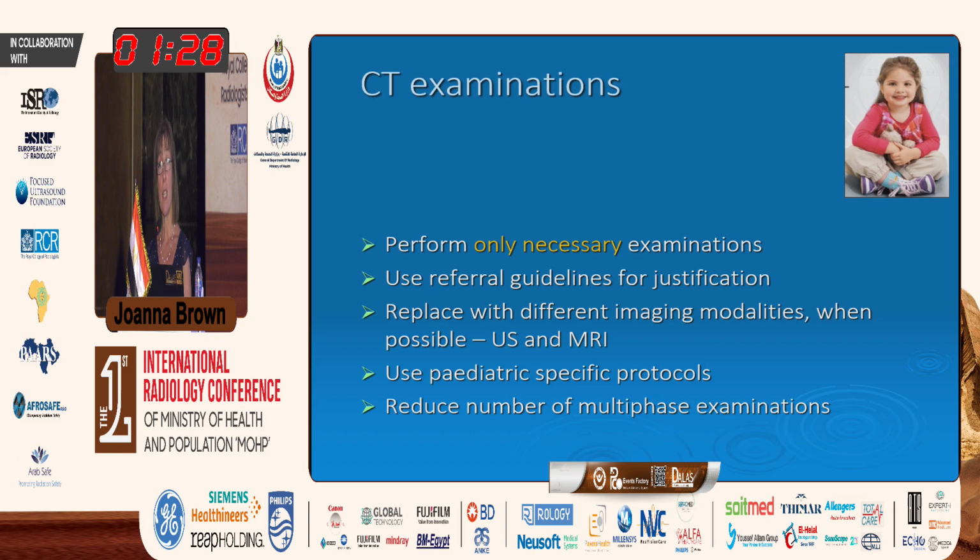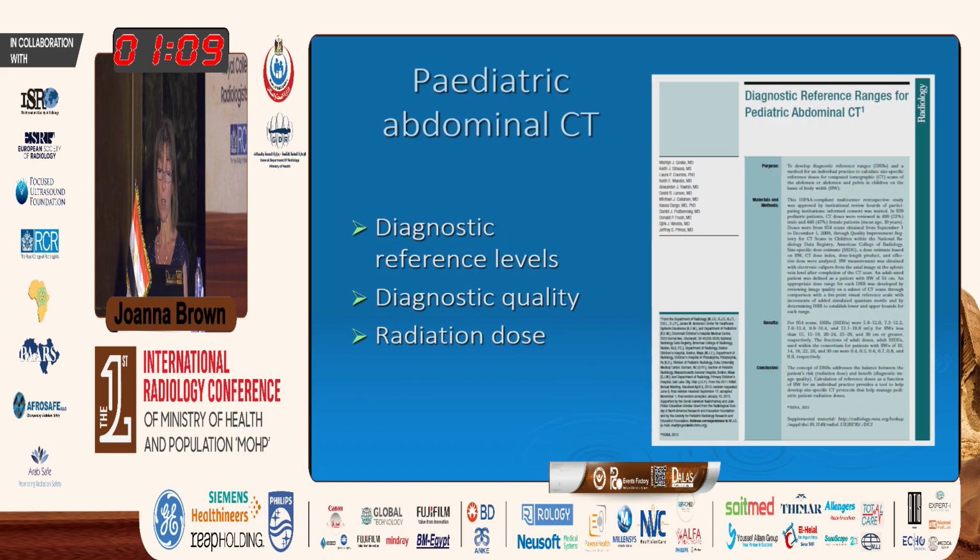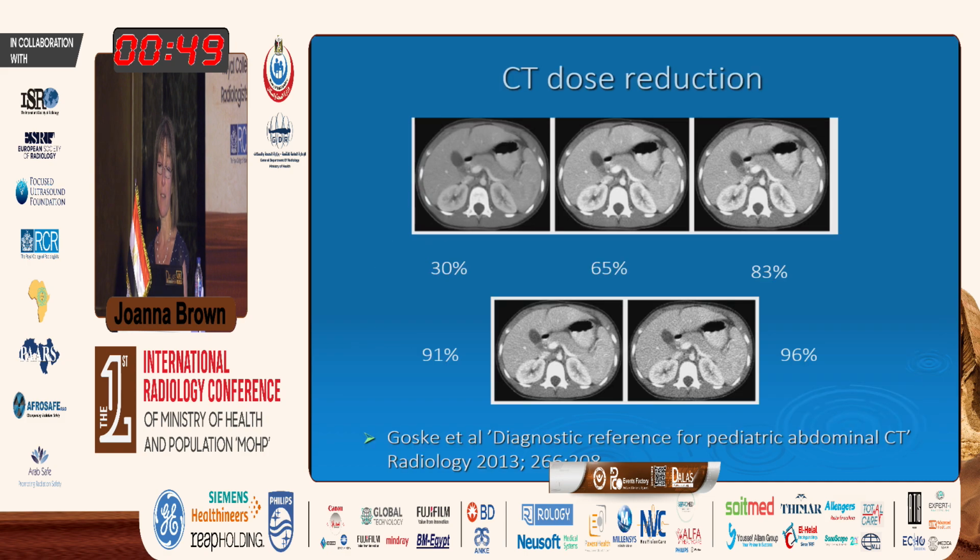So with CT examination and any other examination in children, perform only necessary examinations, use the referral guidelines for justification, try to replace CTs with other modalities like ultrasound and MRI, and use specific pediatric protocols with a reduced number of multi-phase examinations. And as Ola showed you during the previous lectures, there is a lot of information available on the IAEA website, but also free publications, like this article about pediatric abdominal CT and diagnostic reference levels.